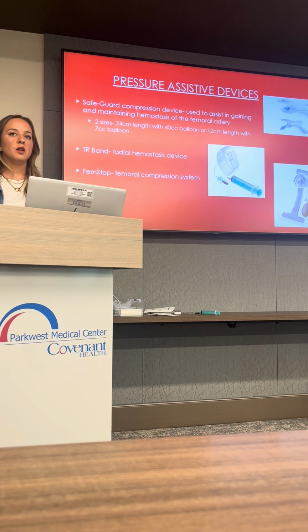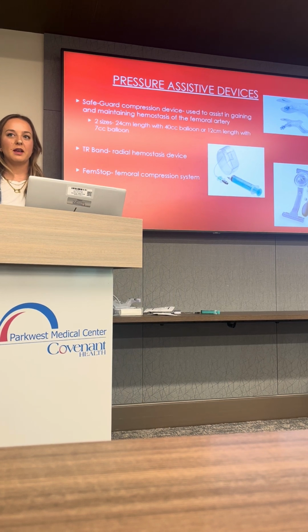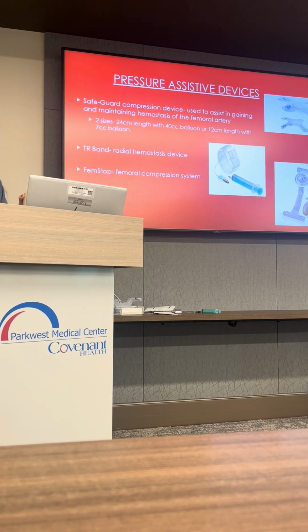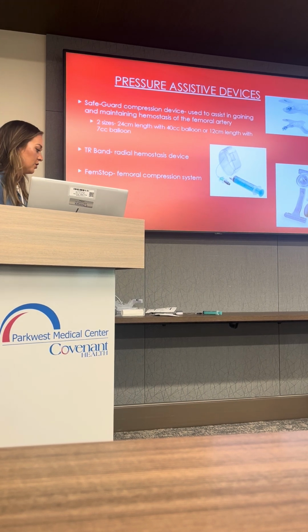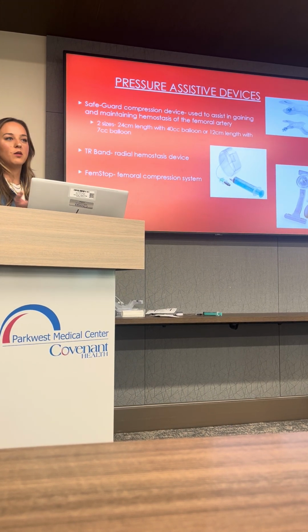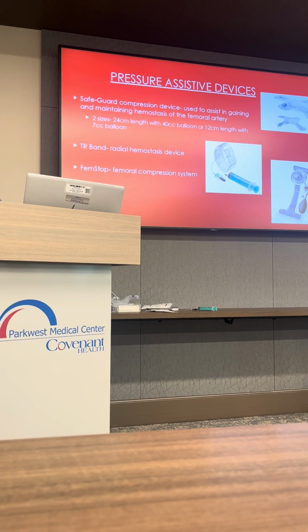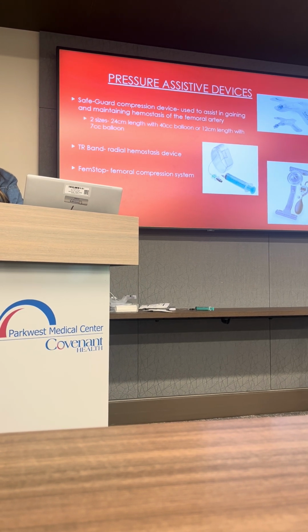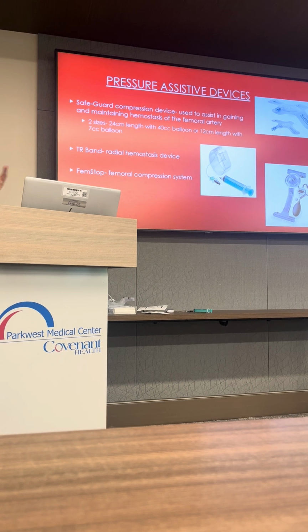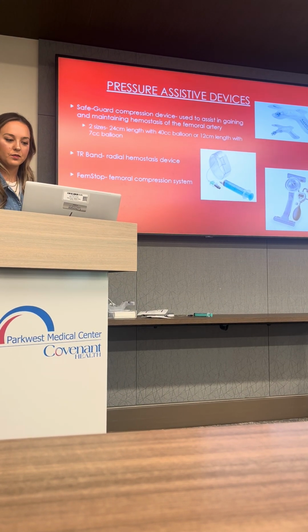A femstop shouldn't just be a Band-Aid because you're getting tired of changing a dressing. If it's significant enough that you're frequently holding pressure or changing dressings often, that's something we need to be aware of so we can troubleshoot and fix that problem, rather than throw a femstop on there, because that could not only affect the vascular access of the patient, but it can impair the pump function as well if there were any kind of damage. That's a good point, Sydney.